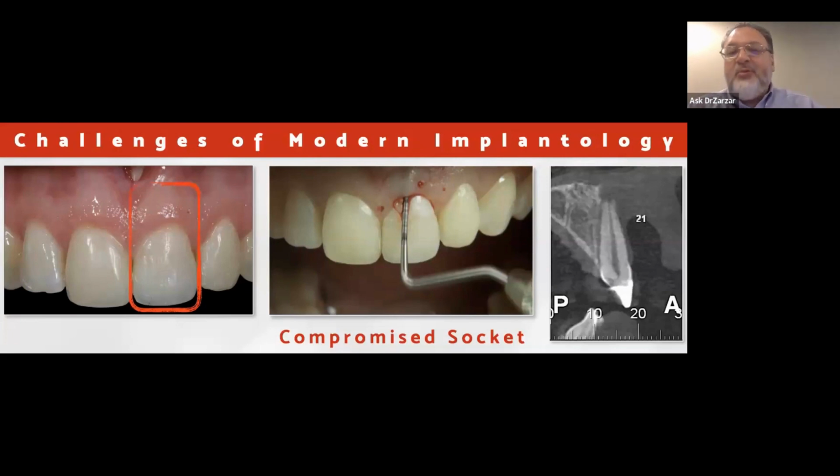Then I would reposition the flap, a very sophisticated suture to keep everything in place, not easy. Many implant cases fail at the very end in the suture, but that's how I would do it. That's how I have done it until 2019 when I met you. Since 2019 and forward, I would do the IDR. But I used to do it that way. But what do you think?